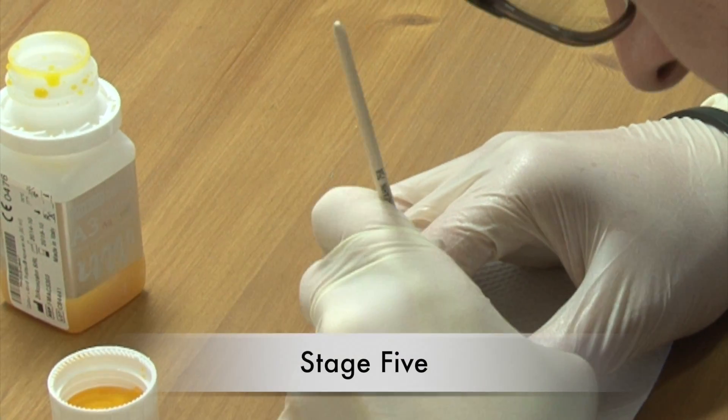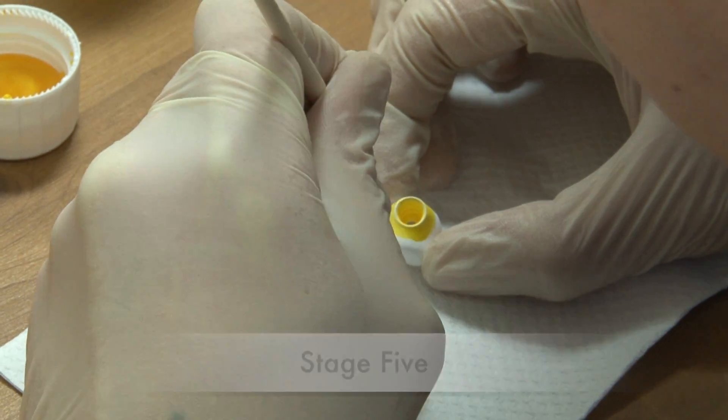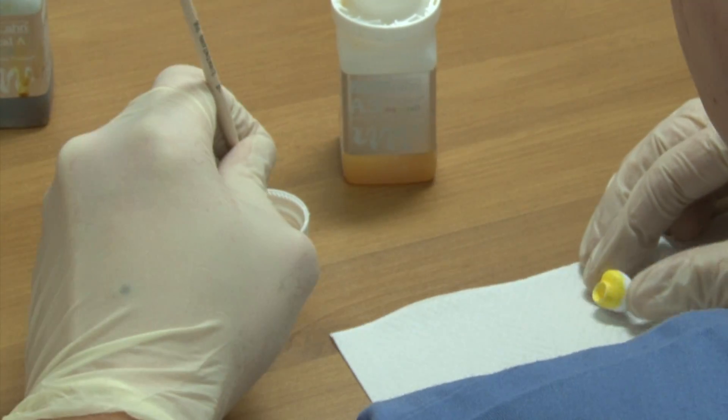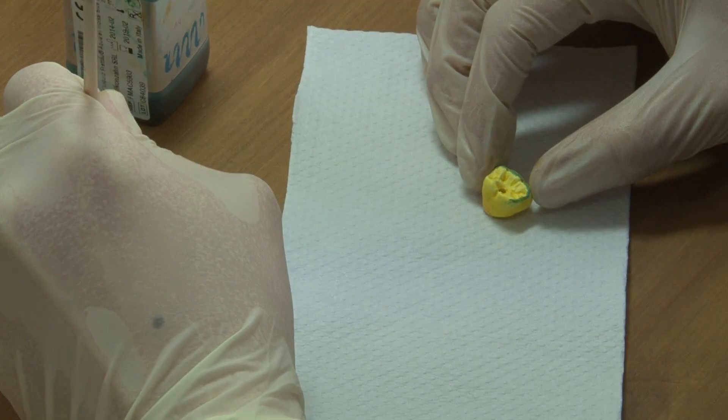After the milling process, the restoration is cut out by the technician from the disc. In the next step, the dental technician will stain the zirconia restoration before the sintering process to the requested shade.